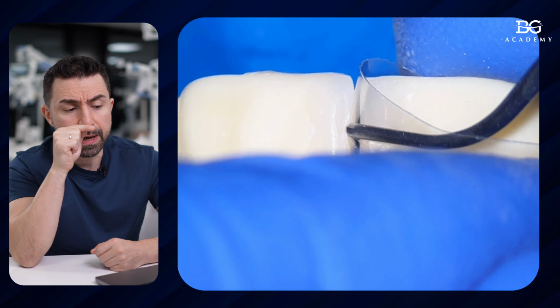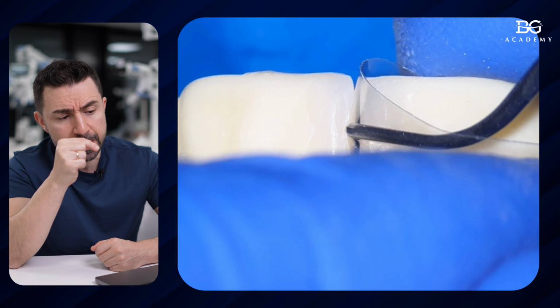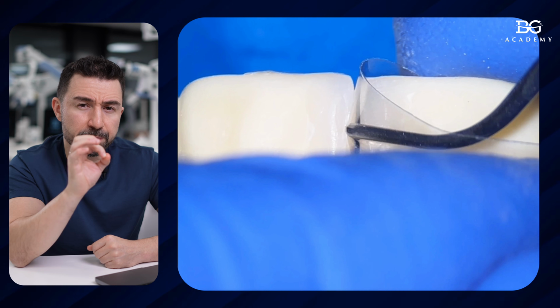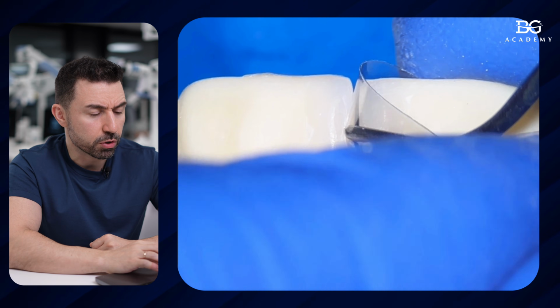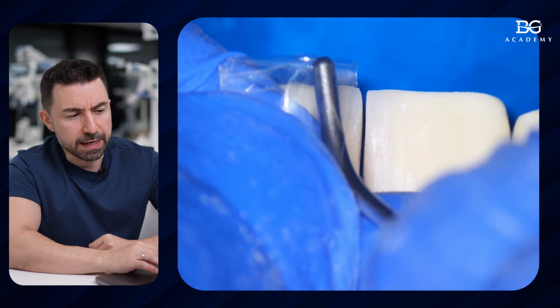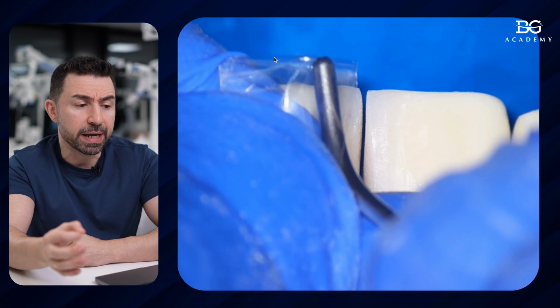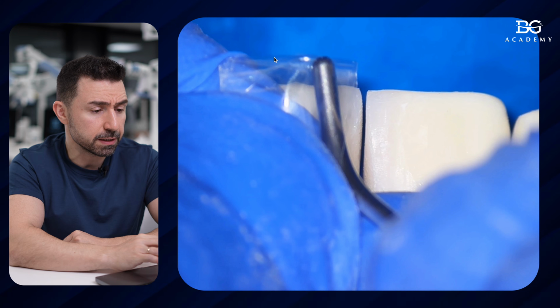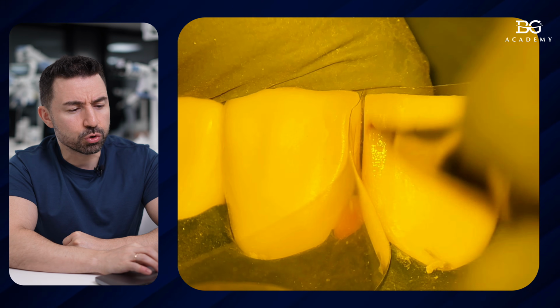Then I use a composite packer. It has to be a very smooth, soft and rounded instrument, and I will point on this matrix the contact point I would like to have in the future, okay? So this is the first thing, and then with a thicker part of the instrument I create a proper contact profile, okay, with the accent to a specific level of this interproximal contact. So that's one trick.